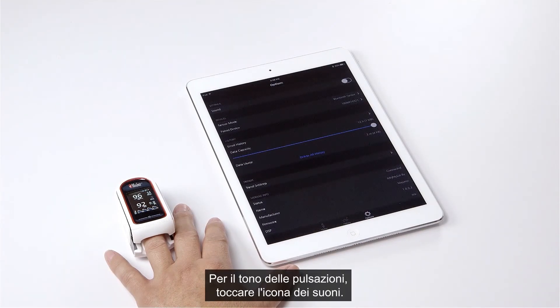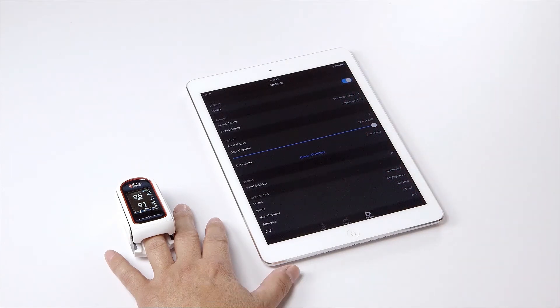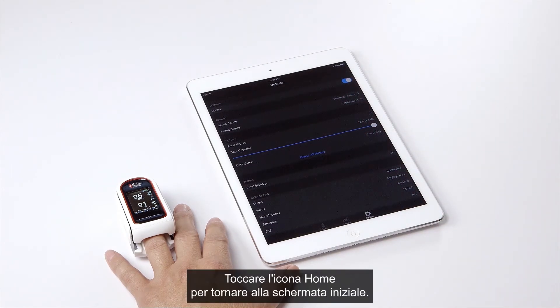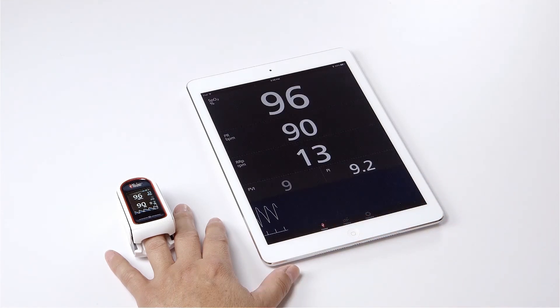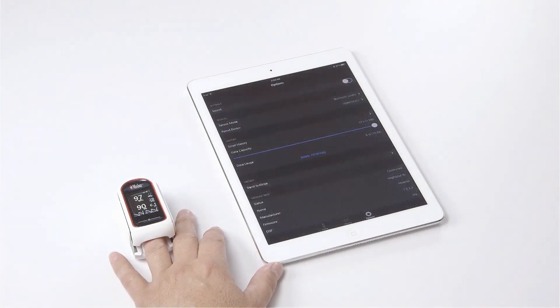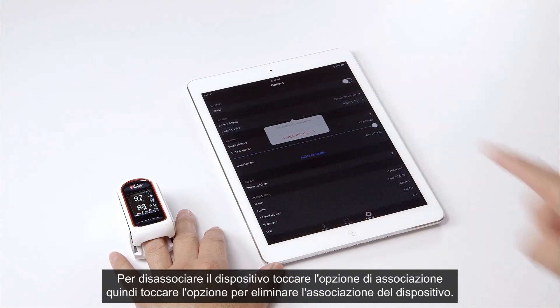To hear the pulse tone, tap on the sound icon. Tap on the home icon to return to the home screen. To un-pair the device, tap paired device and tap on forget this device.